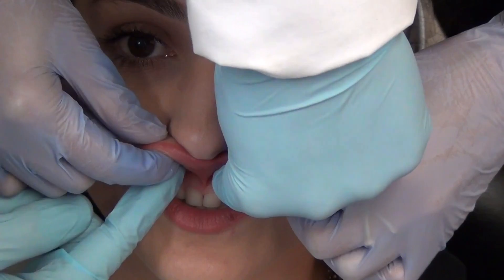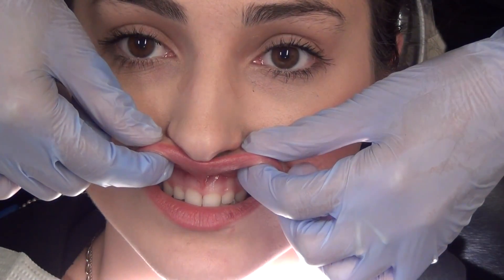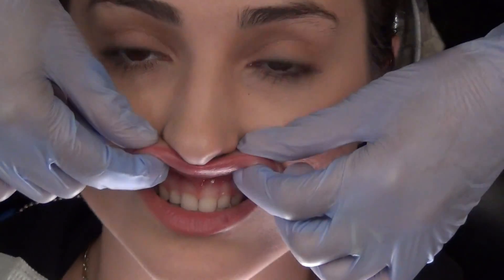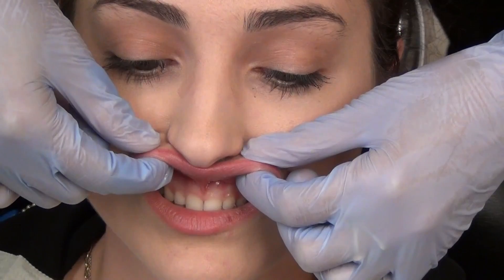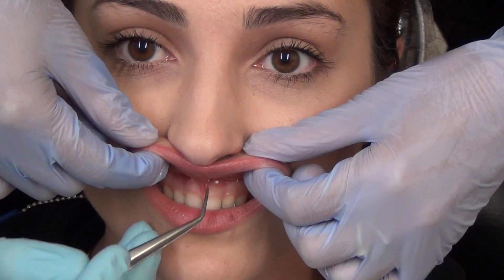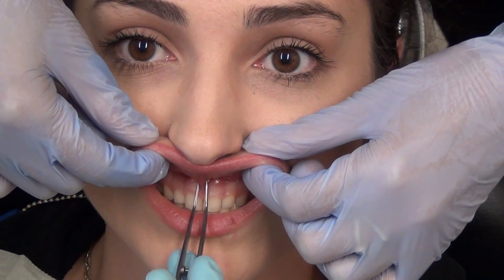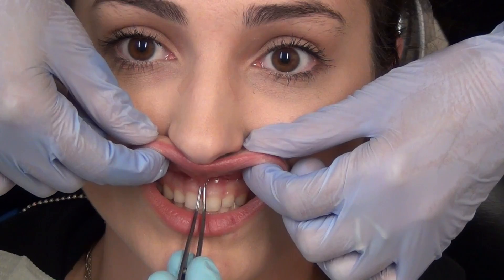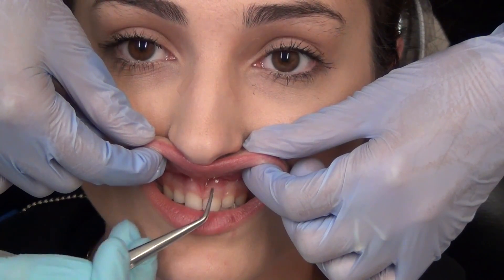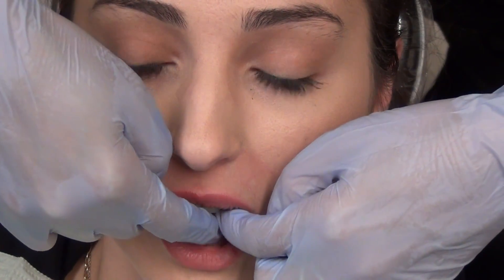So pretty much, we're getting rid of this part here because it's gonna cause a problem in the future. And it's gonna be quick.